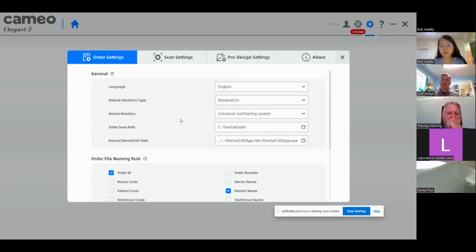I present it to my doctors this way: with the other brands, they have a club, they have yearly fees, and they normally average about $2,500 a year. Some are a little higher. If one of my doctors were to get this scanner at the price it's at, in 5 years the yearly fees almost pay for the scanner. They're wasting so much money on yearly fees, and so that was the main reason why.